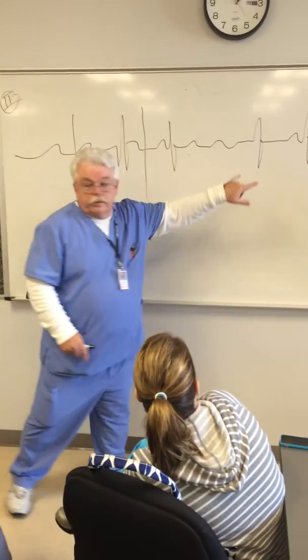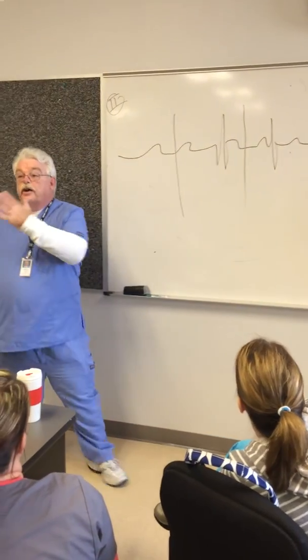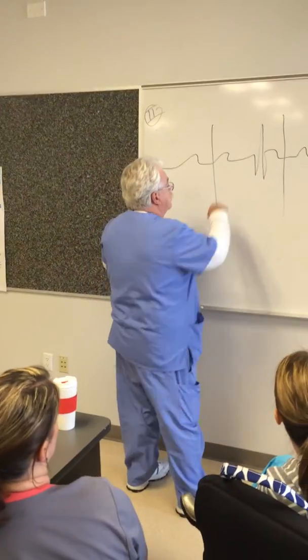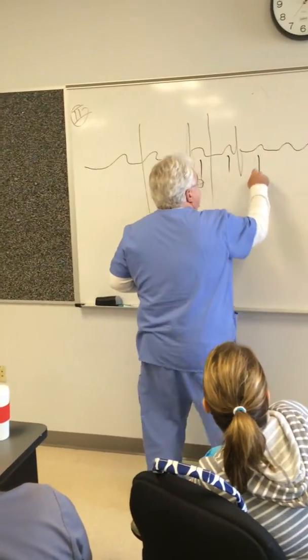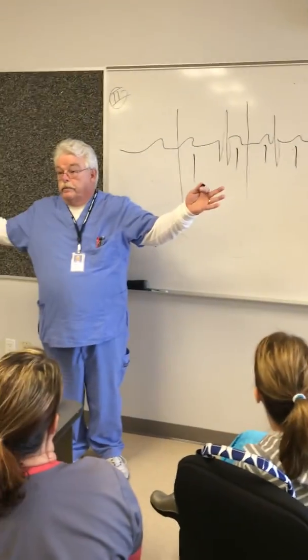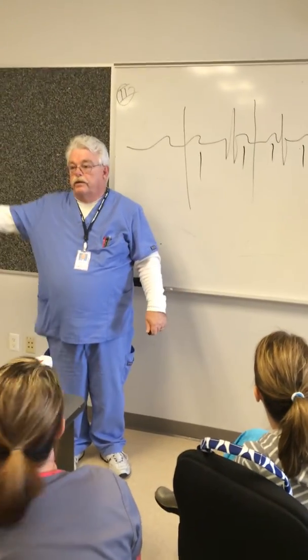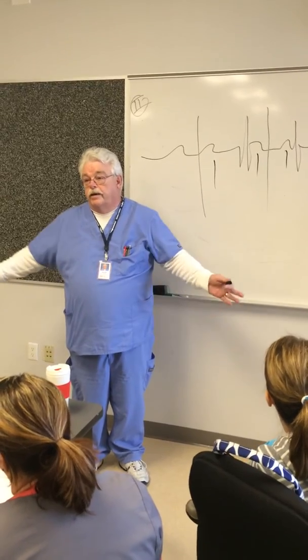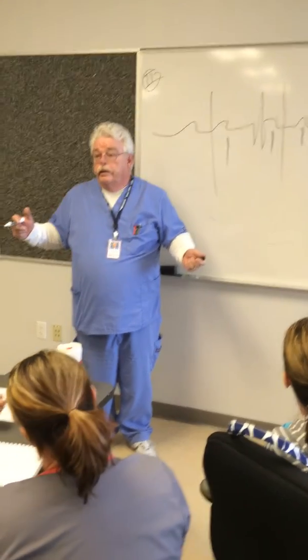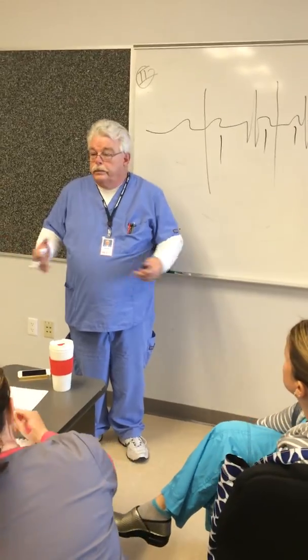The P waves are going to march on their own, and the QRSs are going to march to each other, but not to the P's. You get a piece of paper, make a mark here, and make a mark here, move it over, and these all agree. They're all marching. And the R waves are all marching to some other rate. They're not talking to each other. A P firing is not causing a corresponding QRS at any time. If P's and Q's just don't agree, then you've got a third degree. Those are the blocks. Is everybody cool there? Yeah. That's it.